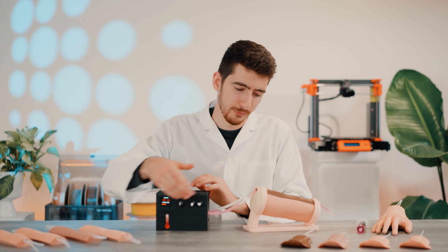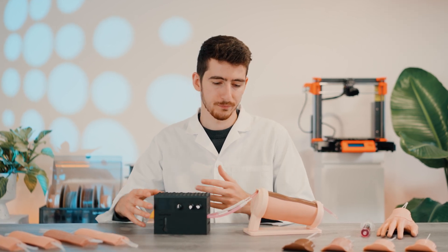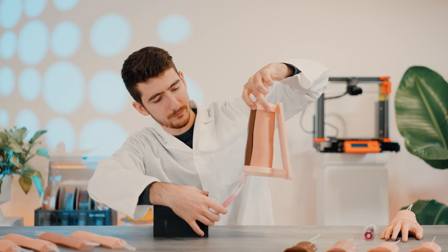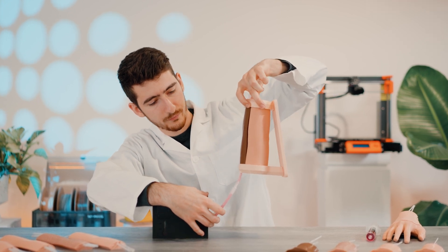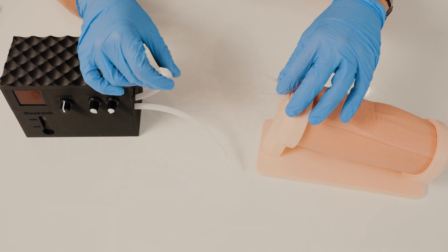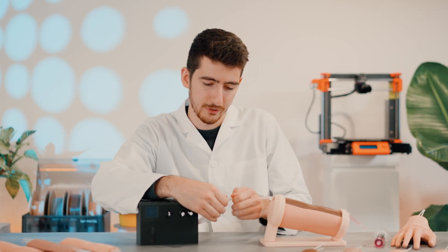In case you run out of blood, it is really easy to refill it. Make sure to turn off the pump. Drain all the blood back into the unit. Disconnect the connection with the silicone product, and remove one of the connectors. You can fill the unit with up to 100 ml of blood.